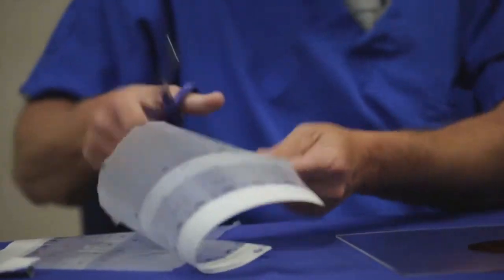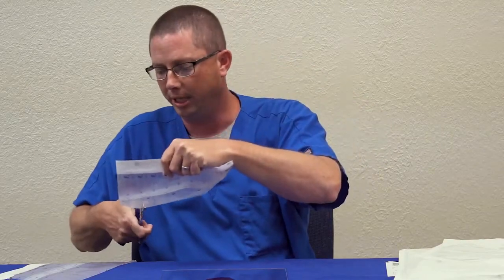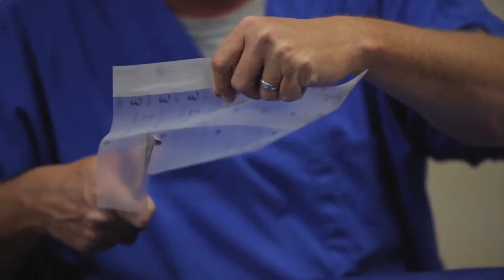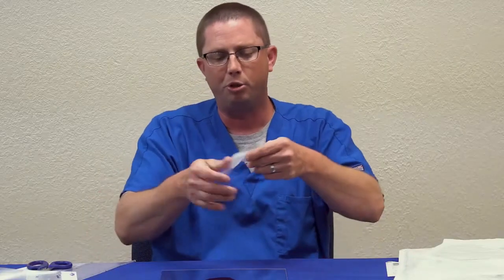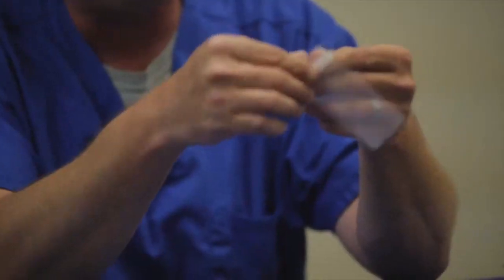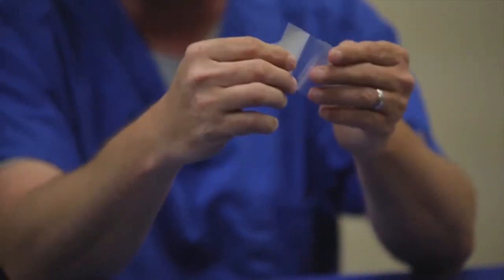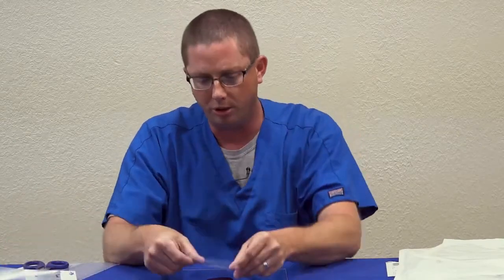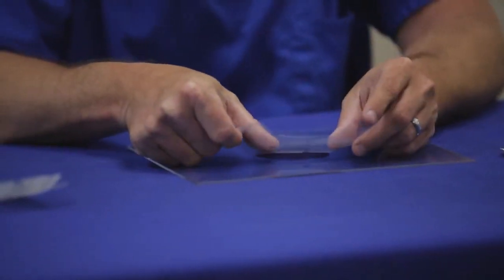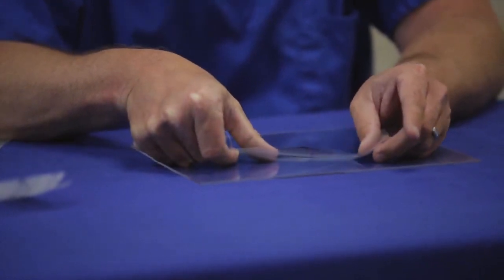Then from here, each line represents 1 inch. So you need to cut 3 to 4 1-inch strips. The drape is removed by removing number 1 first off the back side. Then you can also go ahead and remove number 2. And you want to window pane around the wound margins. This ensures if your foam is slightly too big, it does not come in contact with good skin.